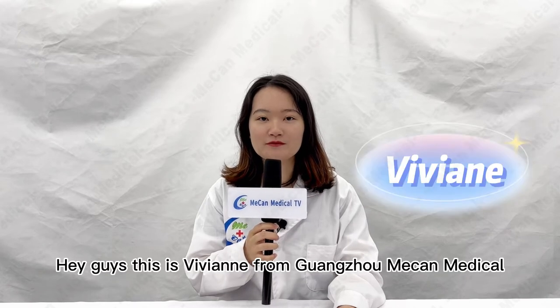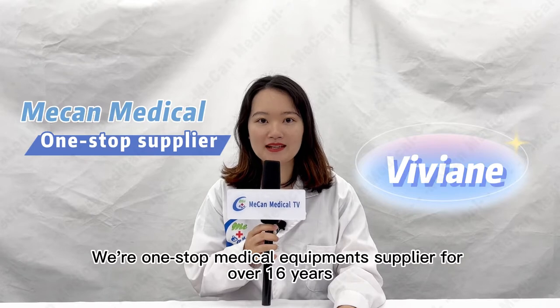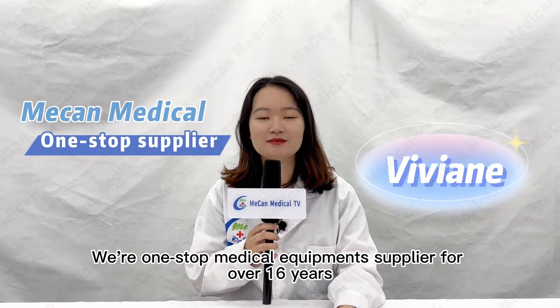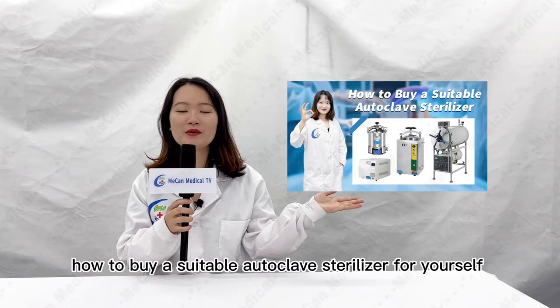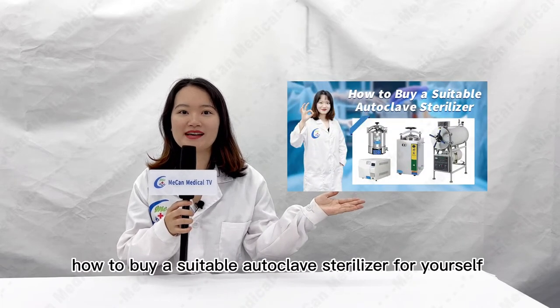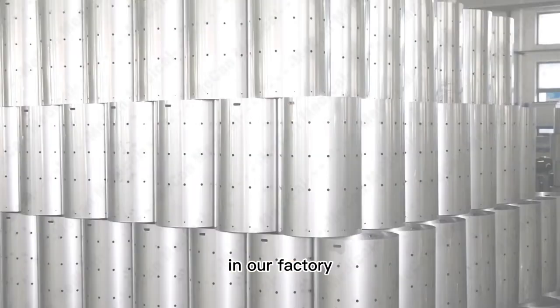Hey guys, this is Vivian from Guangzhou MeCan Medical. We are a one-stop medical equipment supplier for over 16 years. In the last video, we shared with you how to buy a suitable autoclave sterilizer for yourself. Today, I will introduce to you the production process of the steam sterilizer in our factory.